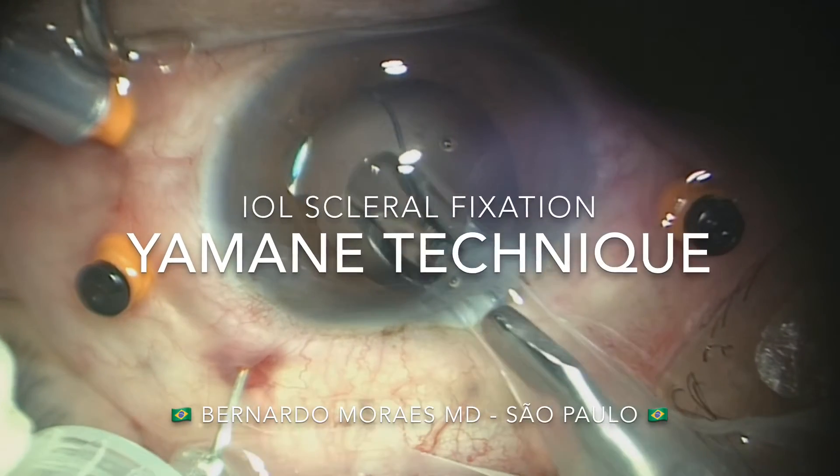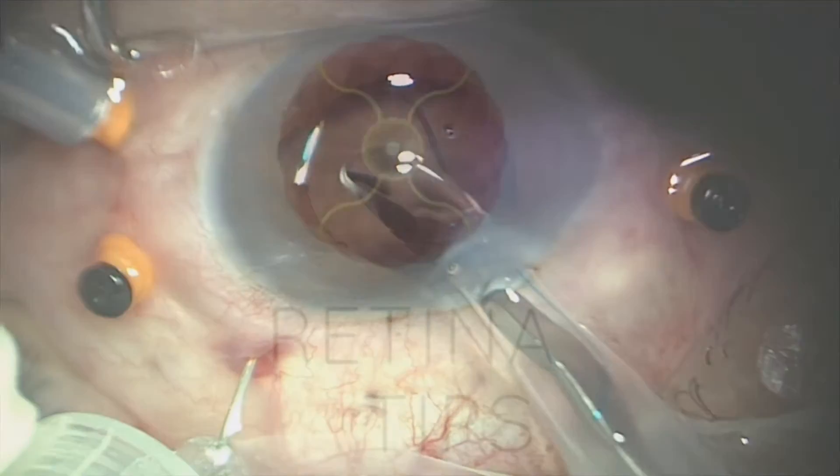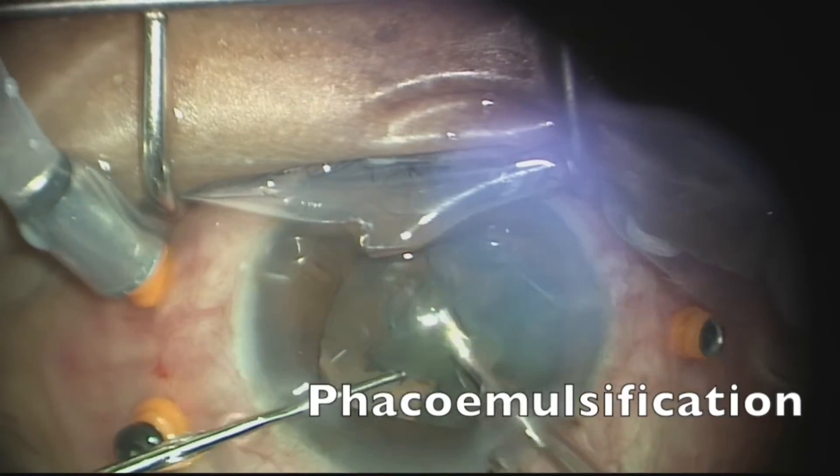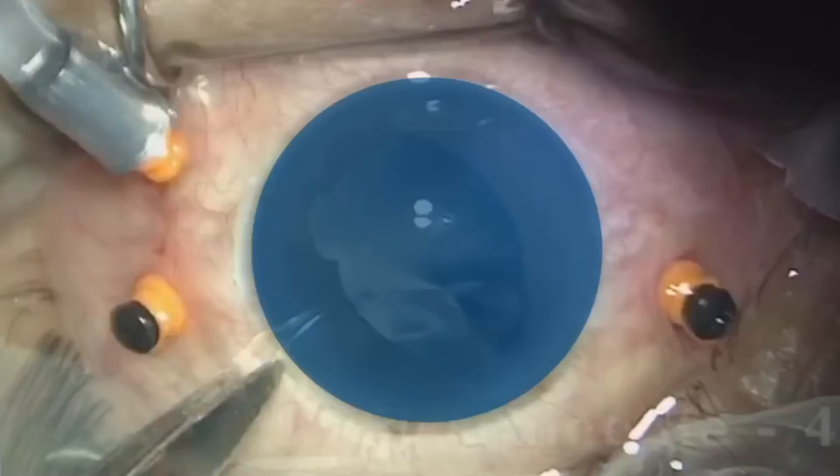This is a video shared by Dr. Bernardo Moraes from São Paulo, Brazil. This is a case of a traumatic lens dislocation managed with combined pars plana vitrectomy, phacoemulsification, and IOL scleral fixation. The surgeon performed scleral fixation using a modified Yamane technique.